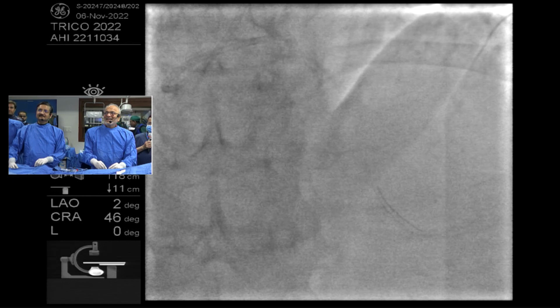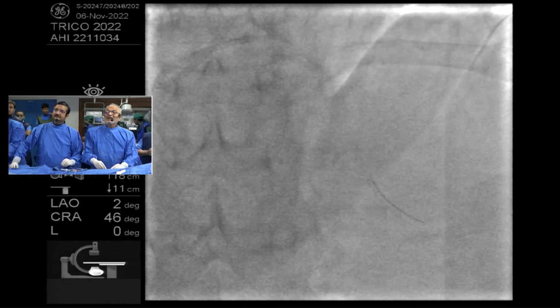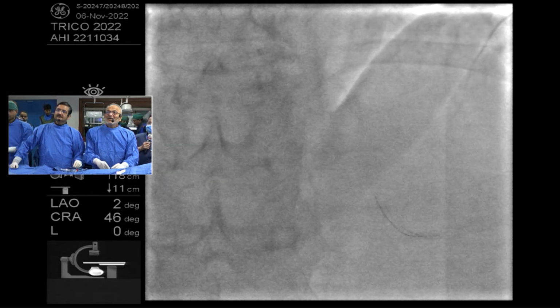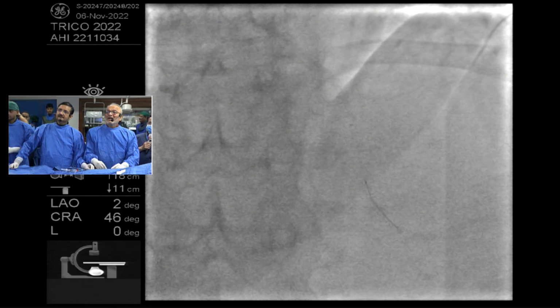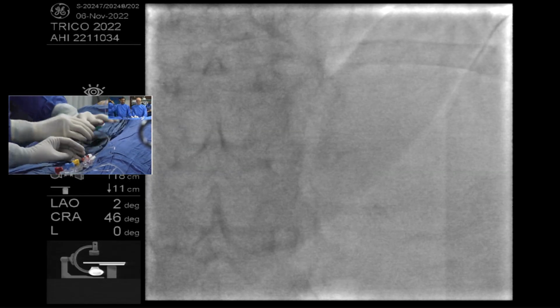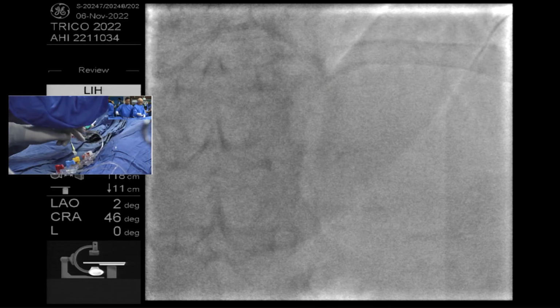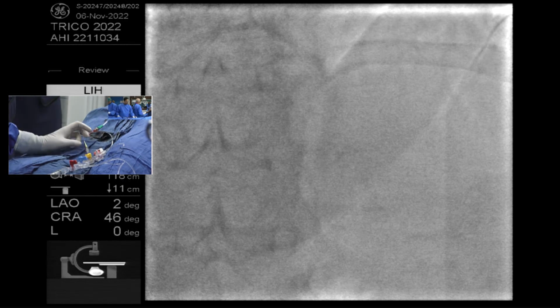So about the burring speeds, with lower burring speeds there would be more of a wobble effect, and therefore the luminal gain would be much more at lower burring speed. That is one of the thoughts. I think with rotablator there is less of that mechanism. With CSI, that is the main mechanism. Yes, yes.